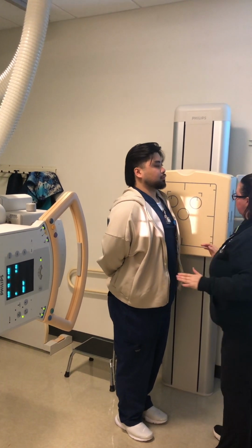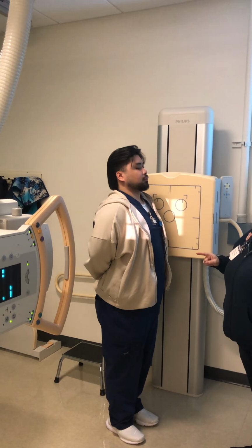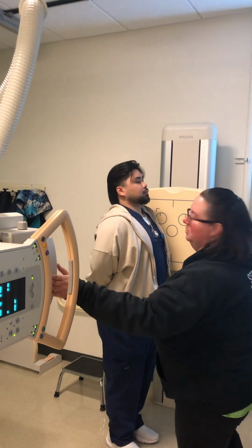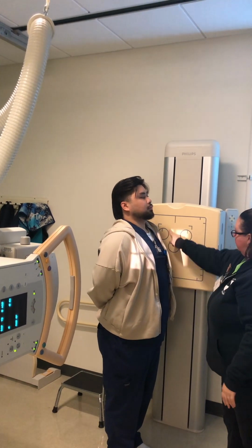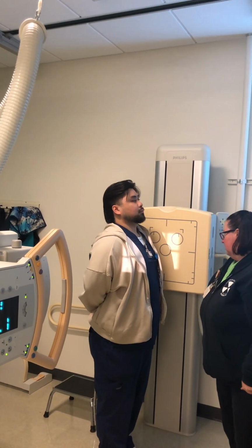My breathing instructions are going to be what? Hold on inspiration. So take a deep breath in. You're going to notice that shadow adjusted. So now I put a little bit more into the actual center spot, okay?